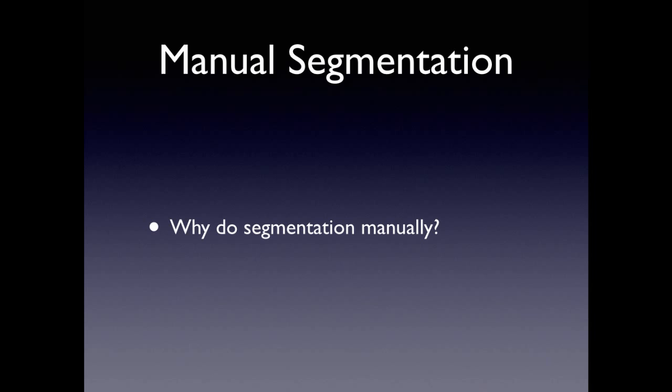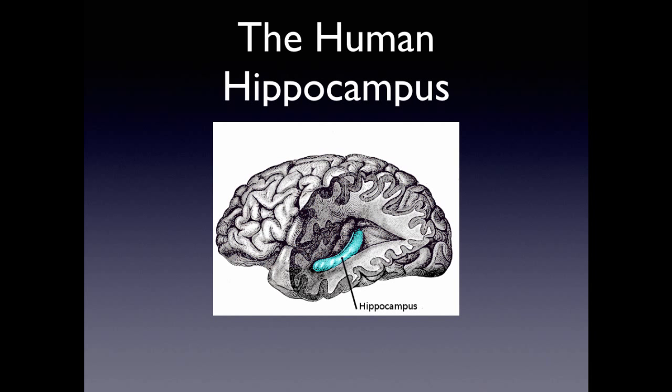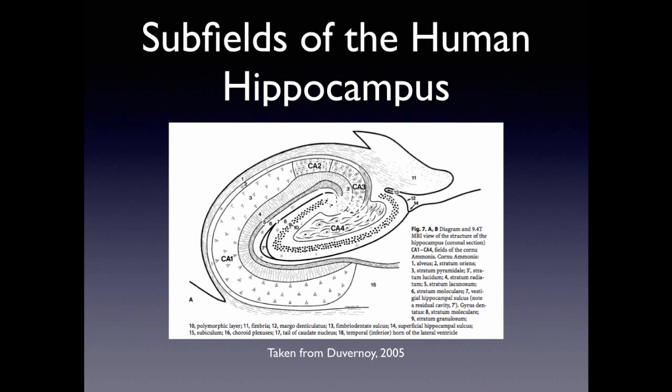A good example of this is the human hippocampus. The hippocampus is the memory center of the brain. It's a small structure located in the deep medial temporal lobe, and it's got this curved seahorse shape. So, this is a coronal slice of the hippocampus. And it's composed of these anatomically distinct subfields. There's this cornu ammonis that wraps around and this dentate gyrus in the middle. And the cornu ammonis is split into subsections, which is called CA, CA1, CA2, CA3, and dentate gyrus in the middle, called DG.